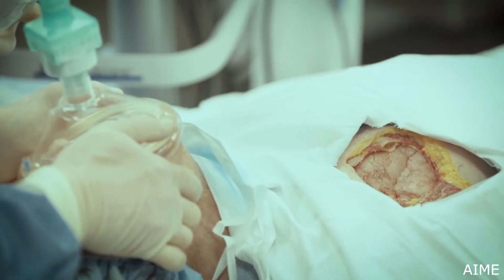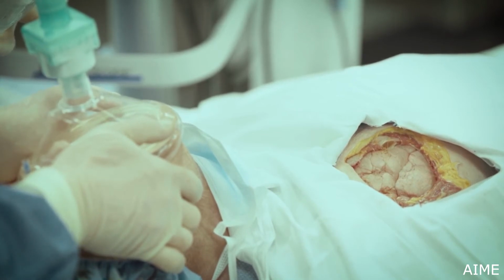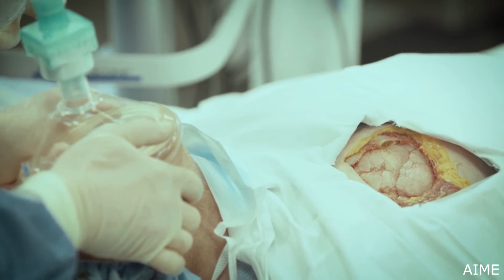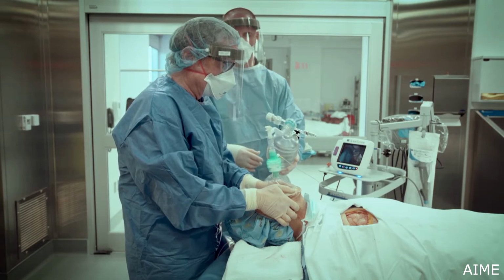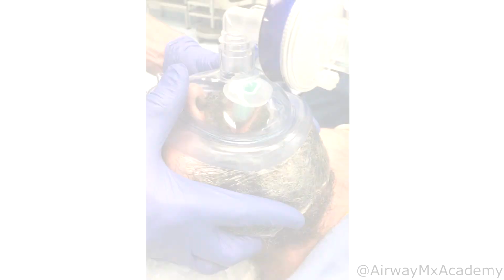You can see here that the continuous positive pressure allows for the recruitment and oxygenation of the lung. There are two things that are crucial to facilitating this. You need a tight seal and an open airway. That means you'll need to jaw thrust the patient when they become apneic. If you need to troubleshoot the seal, for example, if your patient has a beard, you can think about using Mastisol around the edges of the mask seal, or you can actually use a large Tegaderm with a hole cut into it for the airway to allow you to develop and maintain a tight seal.